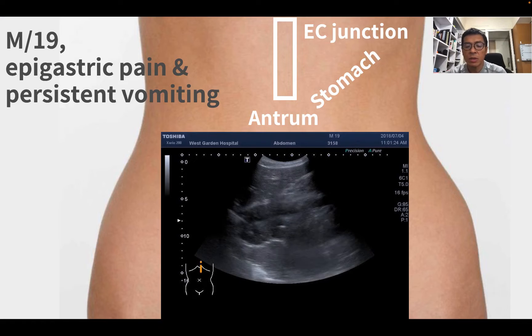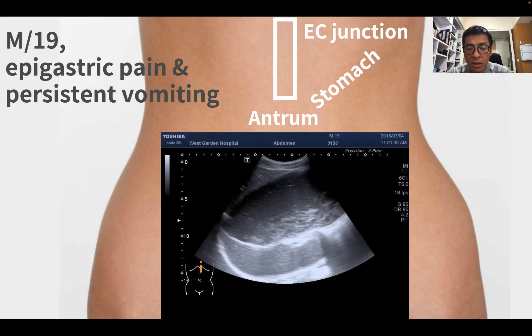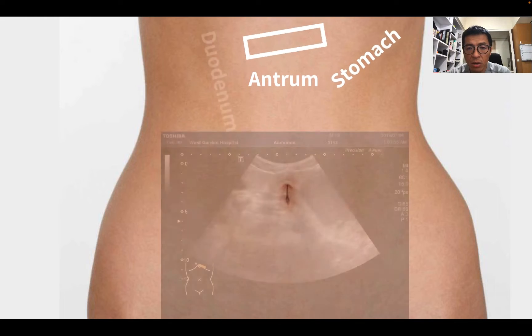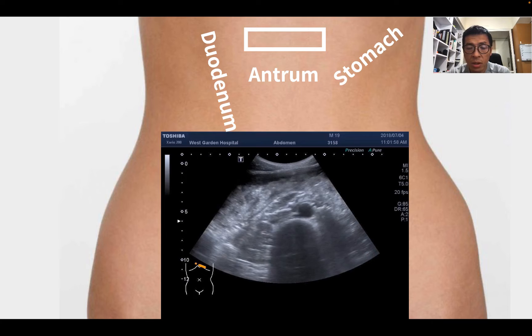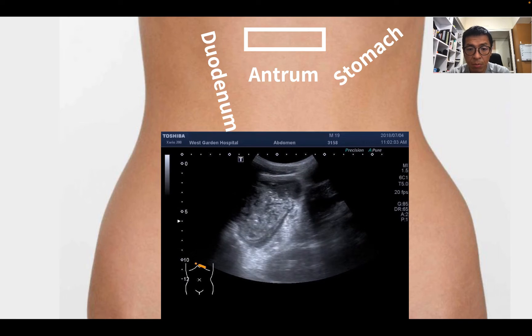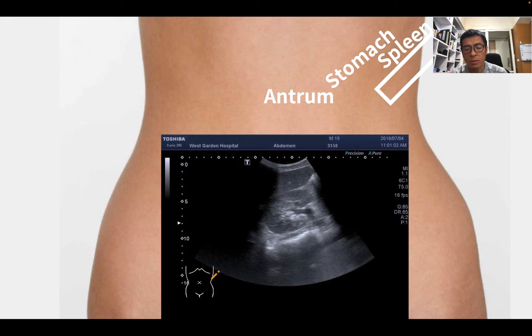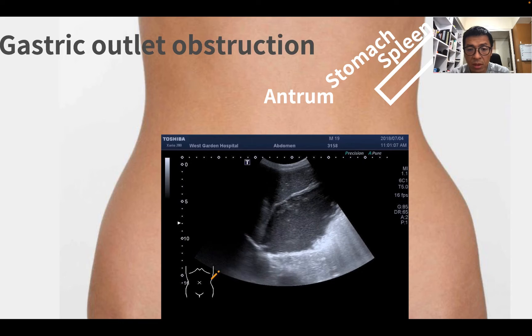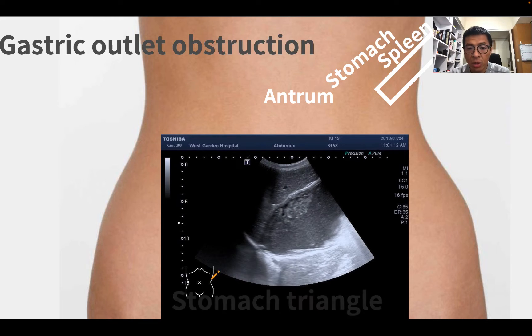In these patients having epigastric pain and vomiting, we started our examination from the EC junction toward the stomach. We see the distended stomach. Rotating our transducer, it is also possible to observe from the stomach antrum going to the duodenum. We can see the duodenum — the second part of the duodenum is distended. It is also possible to observe the stomach from the left flank, using the spleen as a window to see the content of the stomach. The patient was diagnosed to have gastric outlet obstruction.